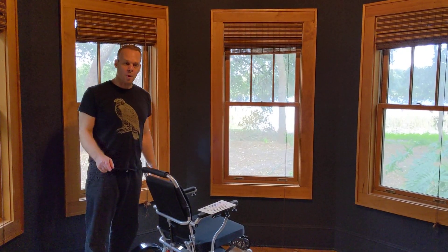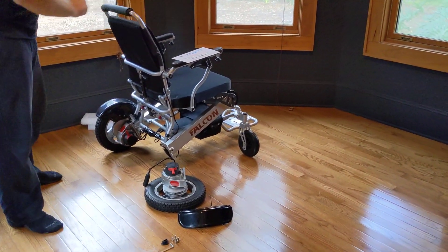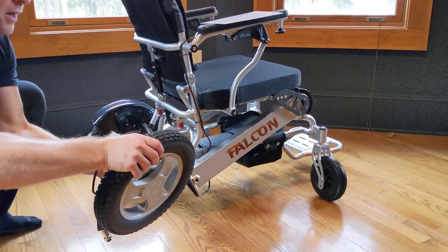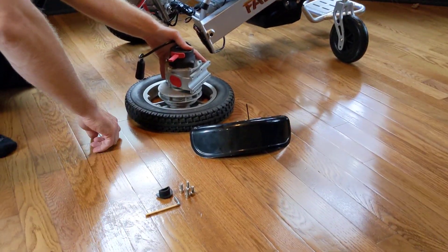Hello, this is Paul from quickenmobile.com. Right here we have a Falcon power folding wheelchair, and we have the 250 watt motor that we're going to be attaching to the Falcon, along with the fender and just a couple of parts.